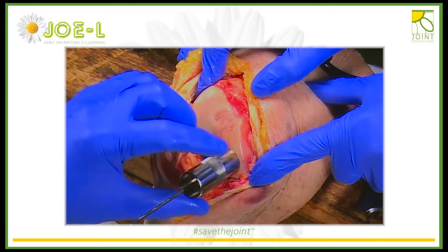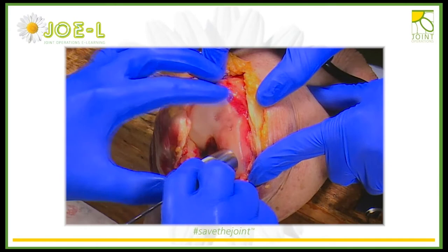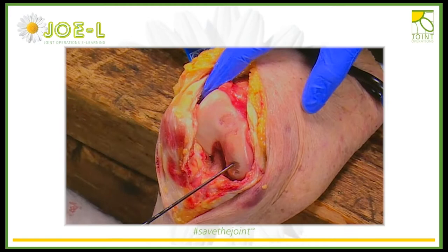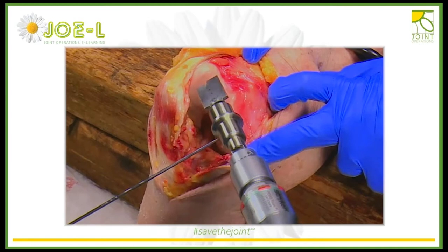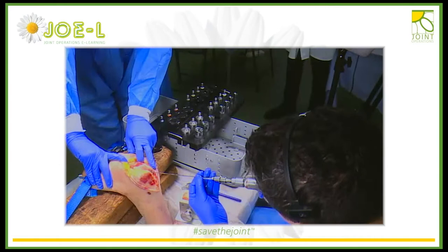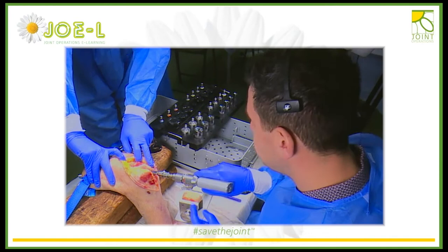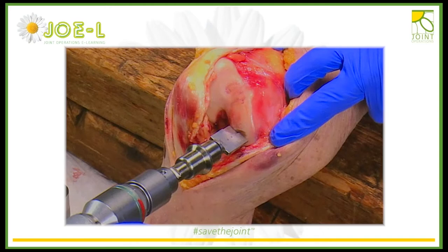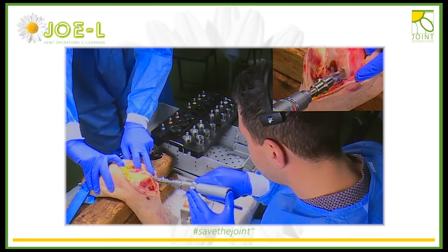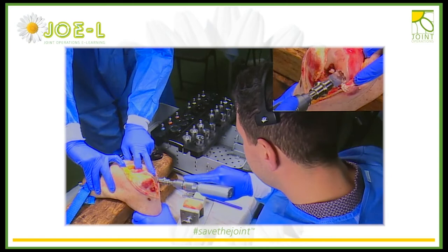I'm going to turn this over — it's got a cut edge and this will give me a cut cartilage surface. Then I'm going to drill it. Here's the drill — it's got the measurements on the side. With allograft, the less bone the better. The depth guidance has changed recently — you can go up to 10mm but it's not ideal. If you have to go more than 10, you probably want to take some autologous bone and bone graft the defect. Ideally I normally go down to about 7mm, giving roughly 5mm bone and 2mm cartilage.